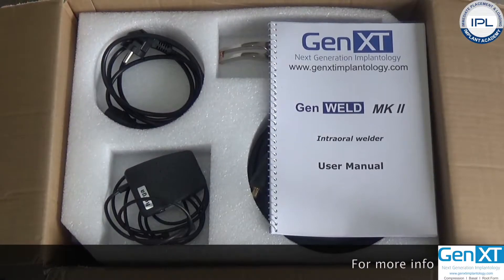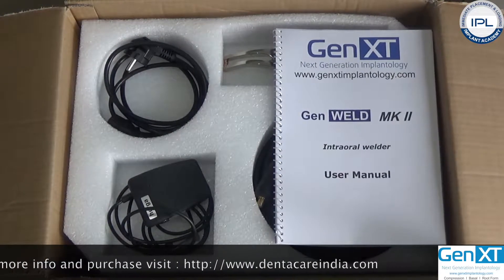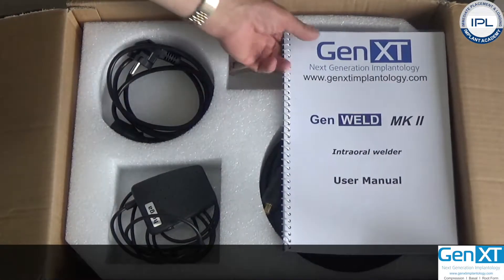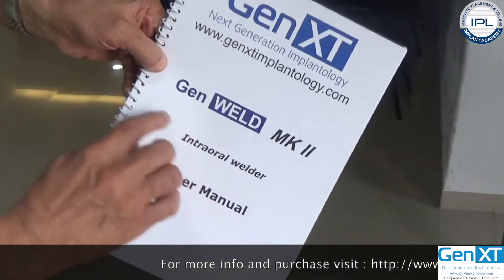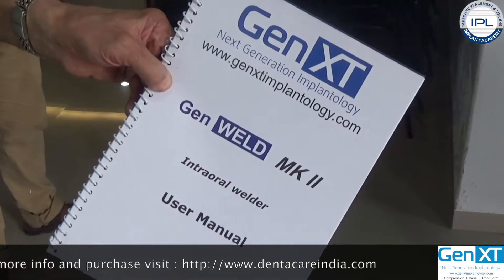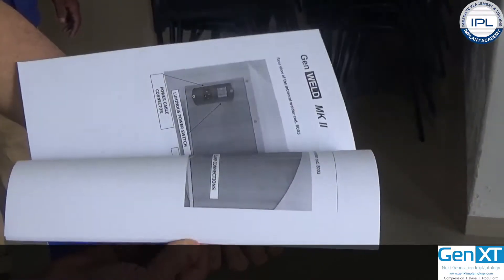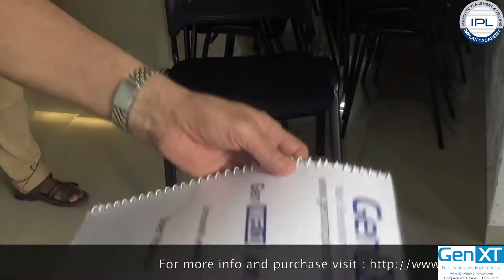A brief introduction on the installation technique of GenWeld Mark II. When you open the box, you have the intraoral user manual for GenWeld Mark II. All the details about installation, use, and various other aspects of the welder are mentioned in this manual.